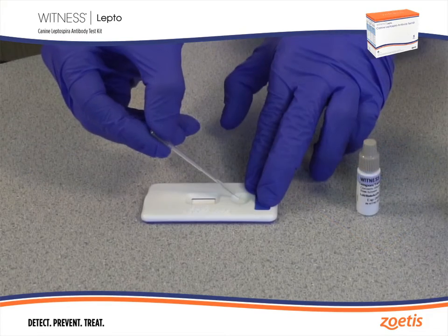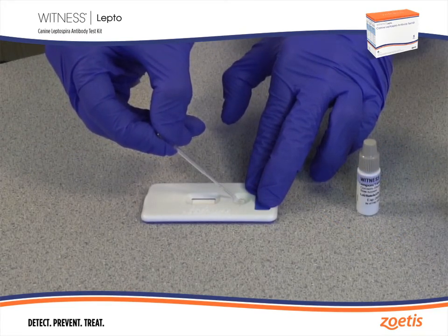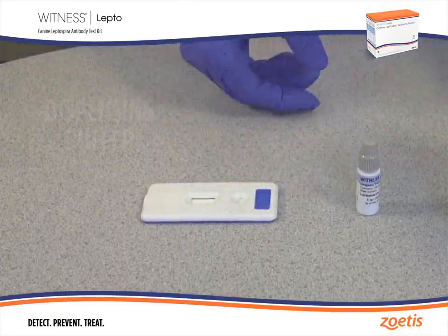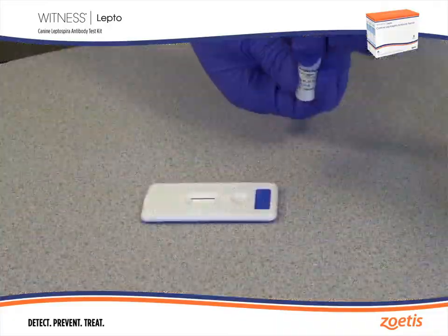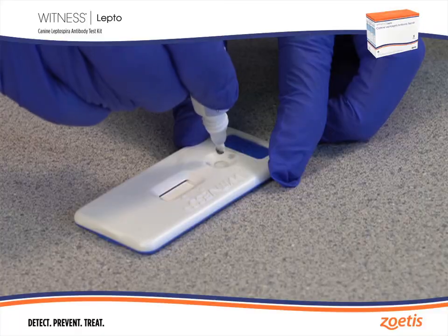Touch the tip of the pipette to the sample pad and carefully squeeze the bulb to express the sample, making sure fingers are covering the vent holes on the pipette bulb. Remove the cap from the buffer bottle, hold it vertically, and add three drops of buffer to the test well.